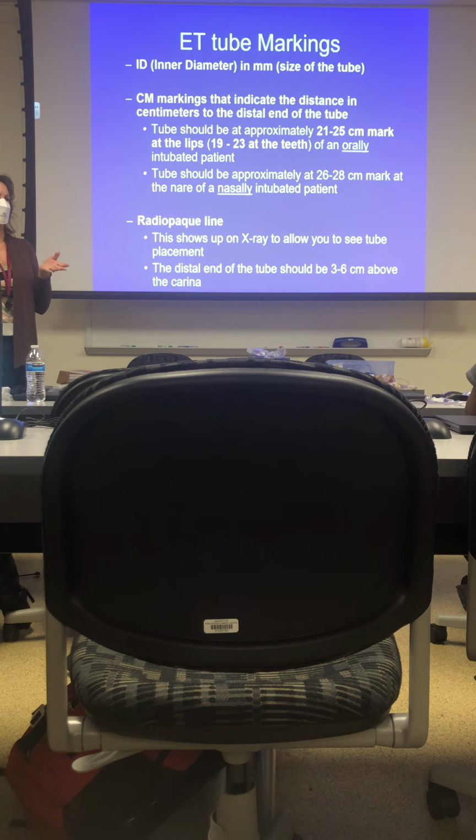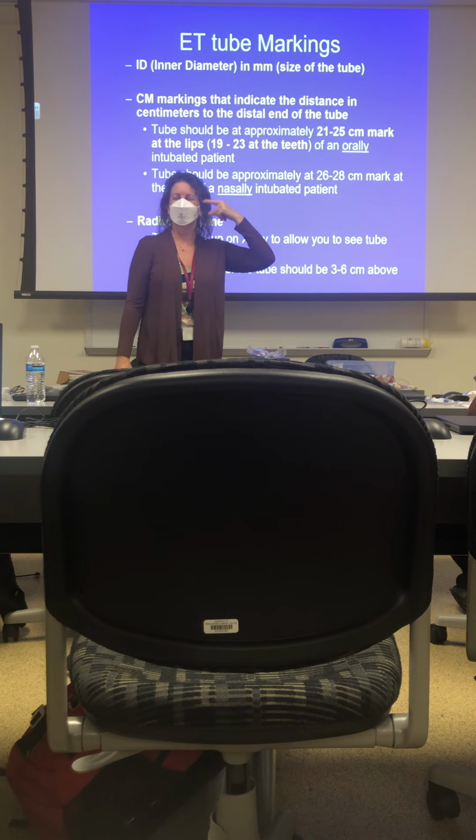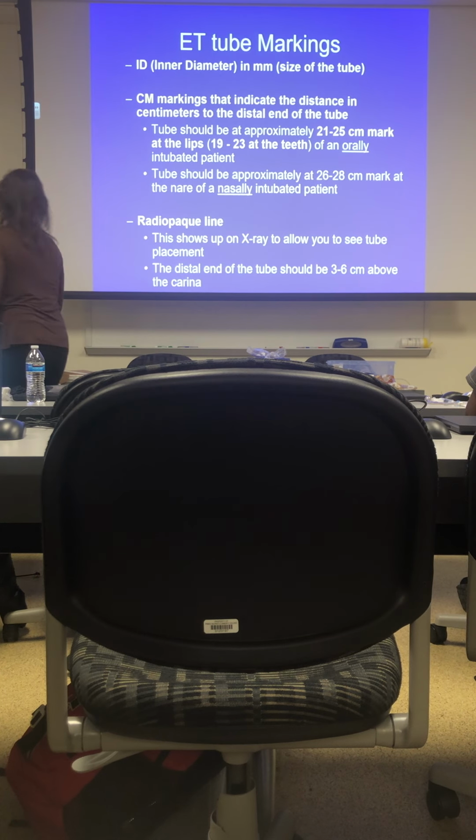But what would be a downfall for nasal intubation? We have a lot of drainage from our sinuses, right? So if you're blocking the nasal cavity, you're not going to be able to drain. You can get a lot of sinus infections. So we don't do that very often anymore, okay? But we used to.